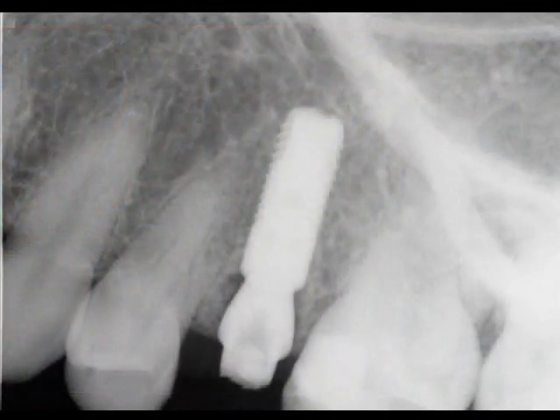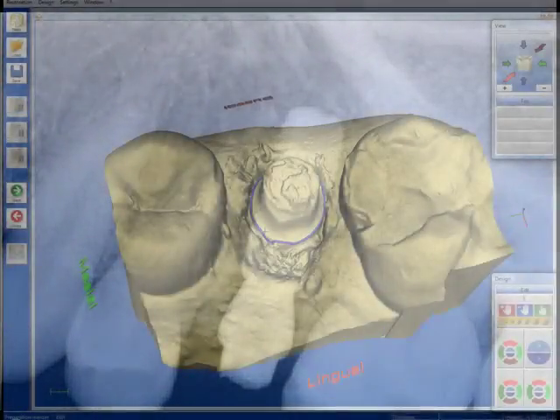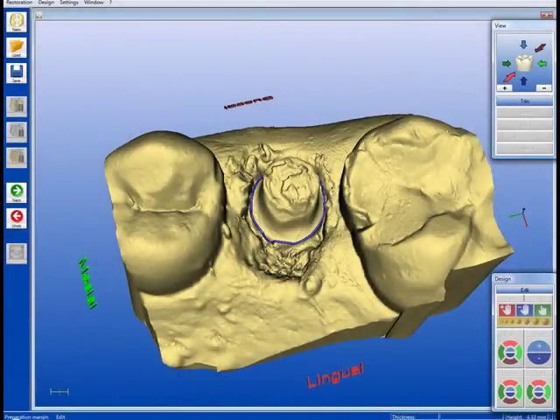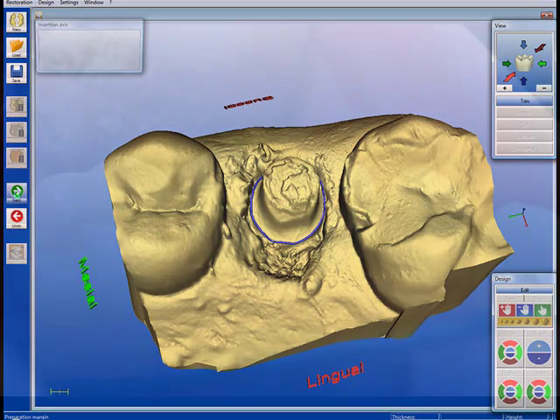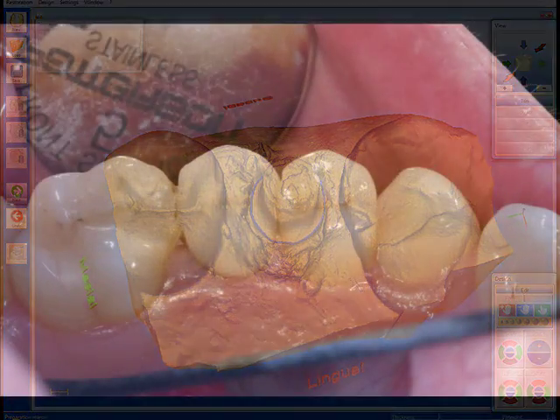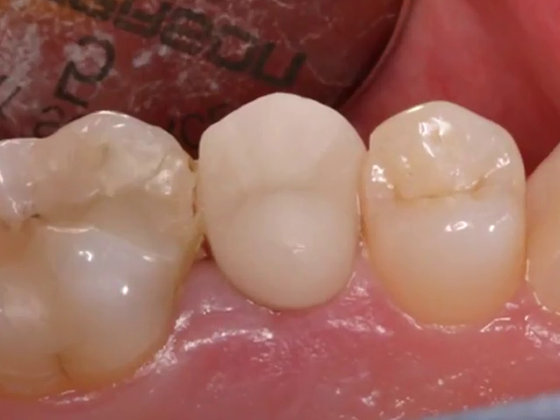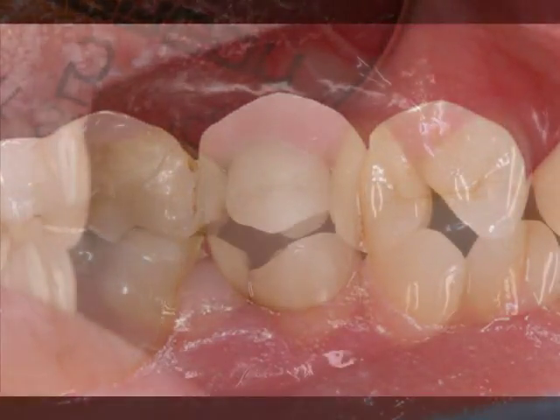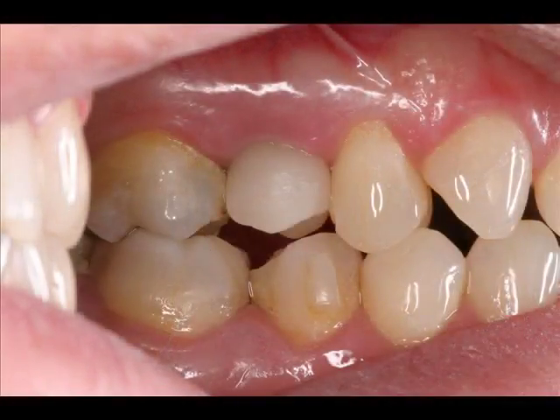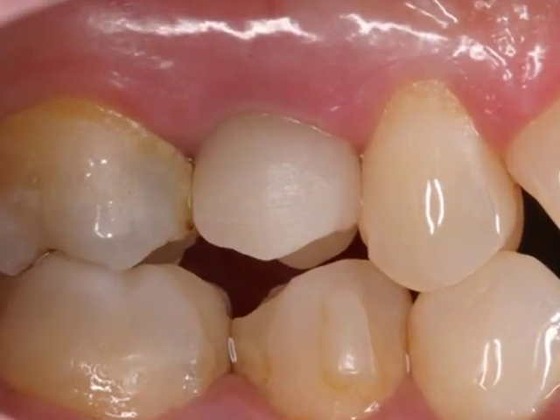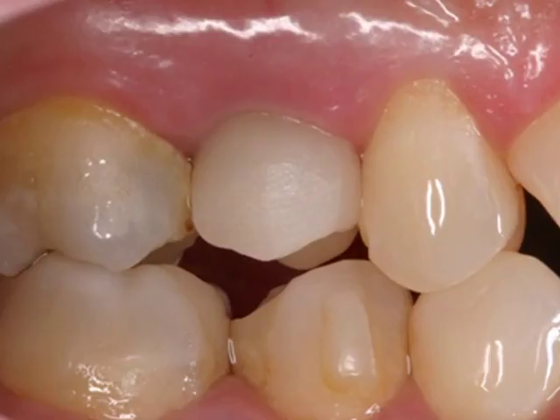Here you see the implant — it was placed exactly where I designed it. I put what's called an abutment on top, or a post. As soon as we're done with the implant placement, I put that post in and I scanned it with my CEREC CAD-CAM device — I scanned this patient's tooth right in the patient's mouth and designed a quick crown. Here is a one-week post-op. We have a temporary crown on here, and the sole purpose of this temporary crown is to keep the gum tissue nice and healthy.